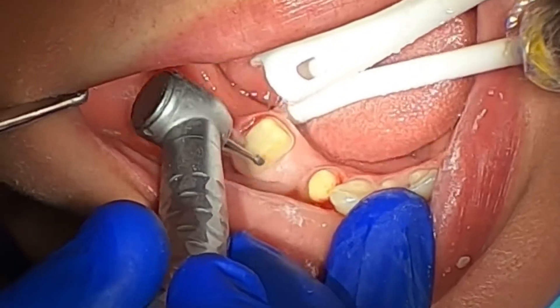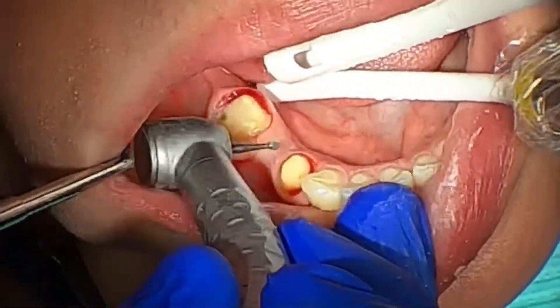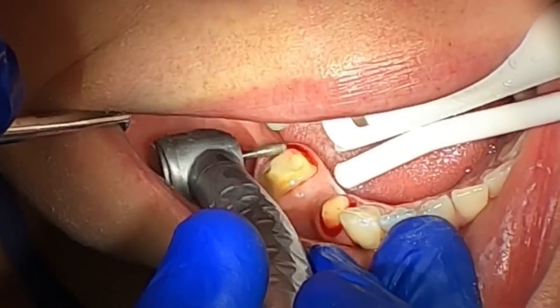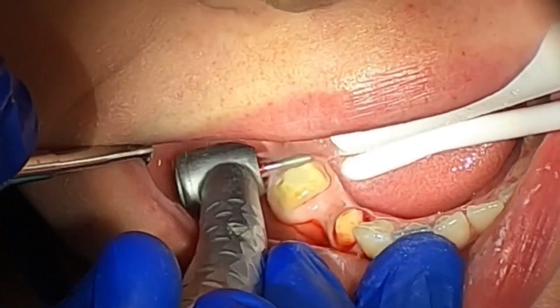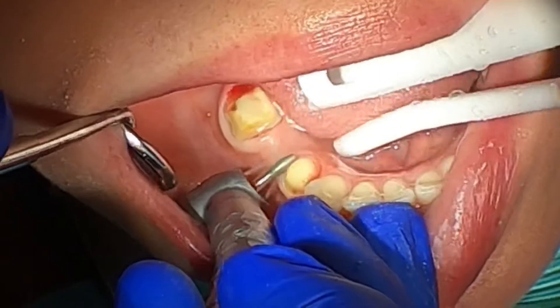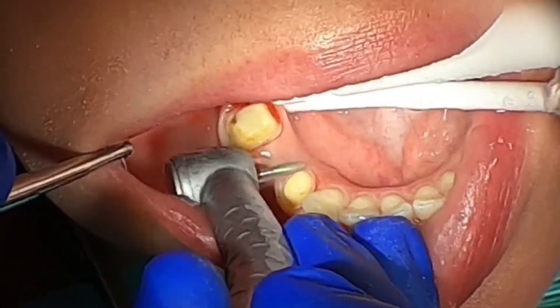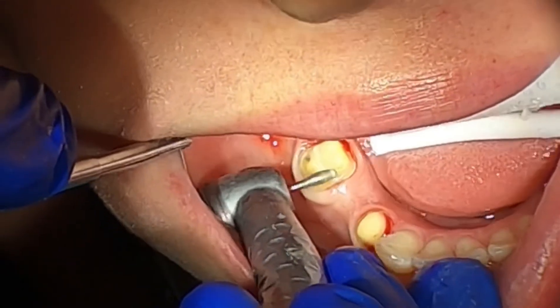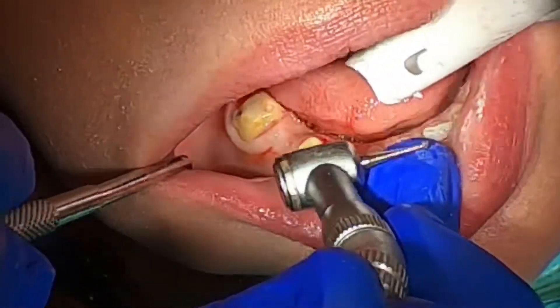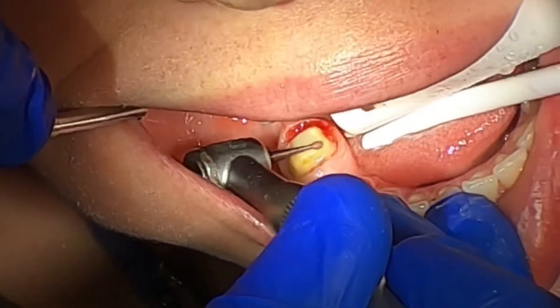A little later on I'll pull out some Viscostat — some aluminum chloride — and scrub it along the gum line. I don't normally use a lot of cord; I haven't used cord retraction in quite a while. Generally, if I prepped the tooth, I know where the margin is, so I have no problem going ahead and outlining my own margin. That begs the question: do you do most of your own crown and bridge design? I really do — I do almost all, if not 100%, of my own CEREC design.